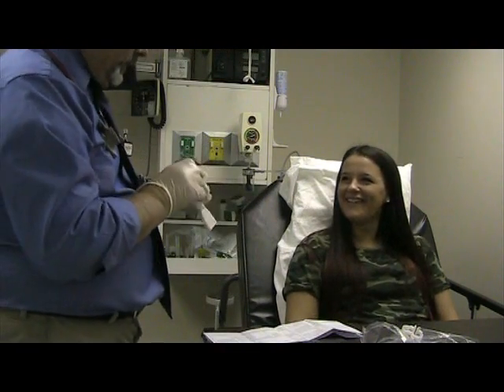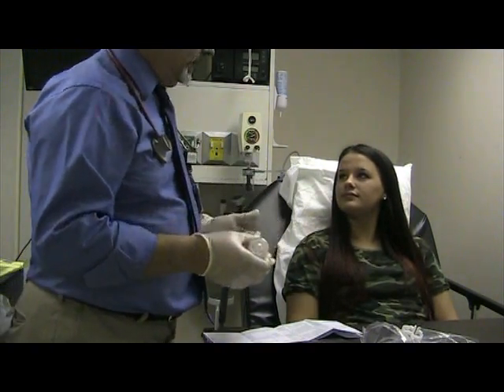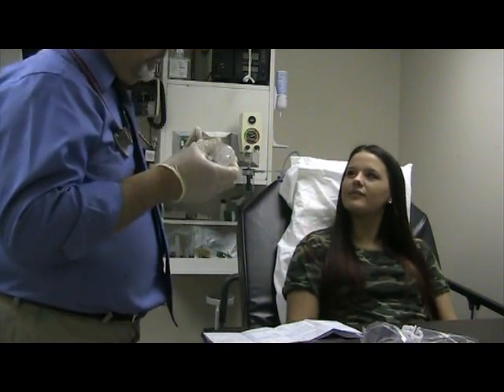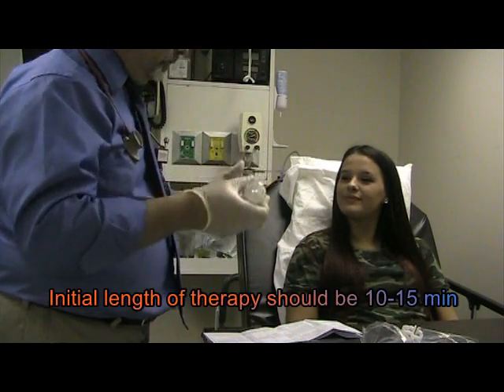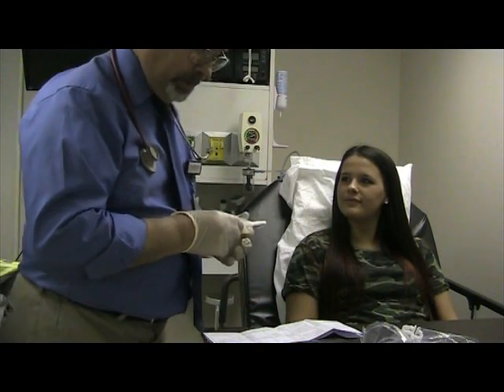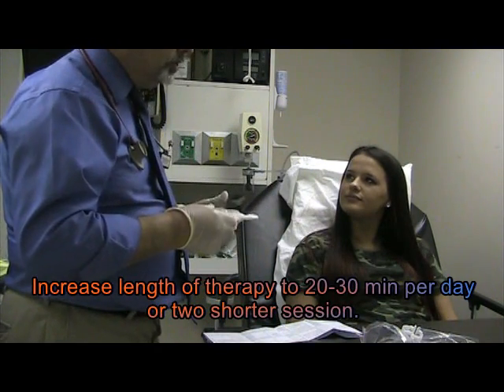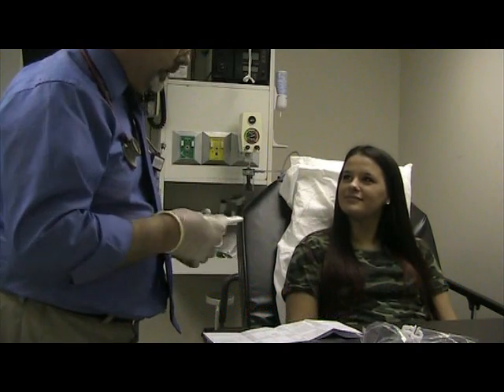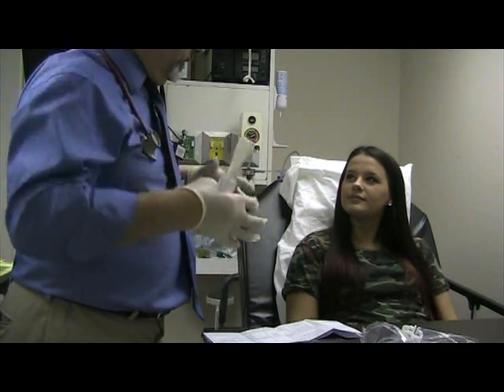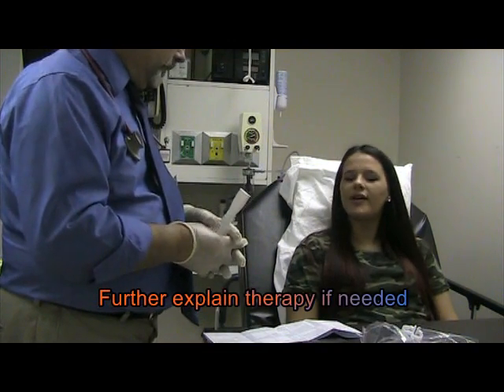What I want you to do is breathe with this about 10 to 15 minutes a day. As you start doing better, we're going to extend this to about 20 to 30 minutes, or have you do it twice a day. What we're trying to do is open up those airways, get you to fill your lungs up, and prevent atelectasis — which could turn into pneumonia.